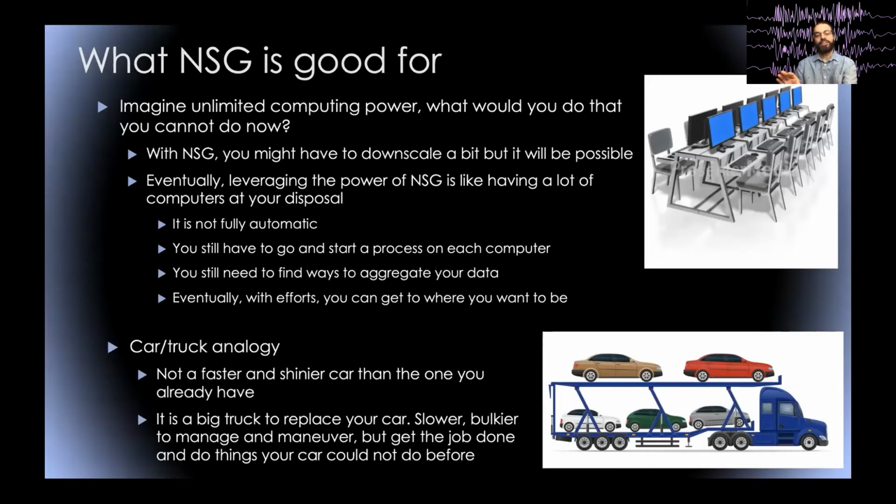What you have is a truck. You have a big truck, so it's harder to maneuver. It's bulkier, but you get the job done, and you can do things you couldn't do before. So it doesn't go faster, but it can do much more than you could do with your car. I prefer that analogy, especially for people who think, oh, it's a supercomputer, just super fast.